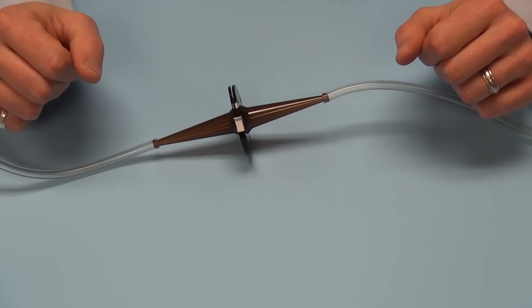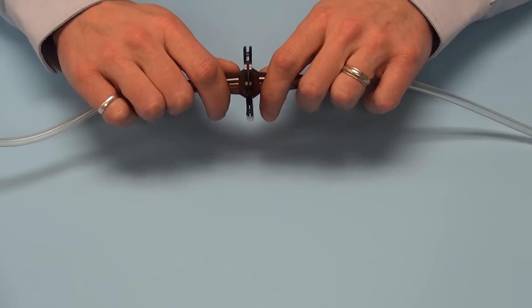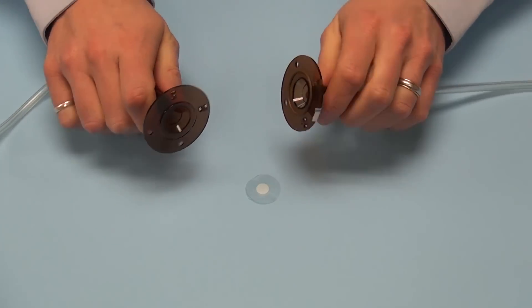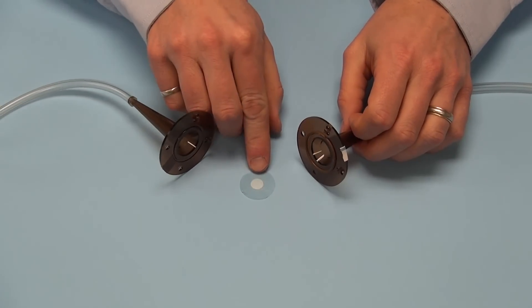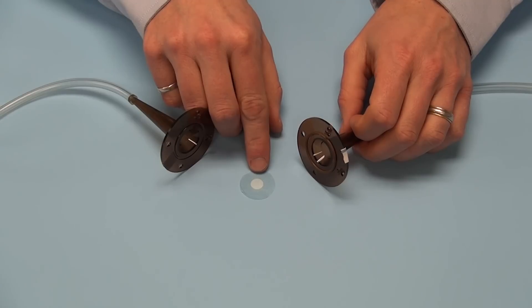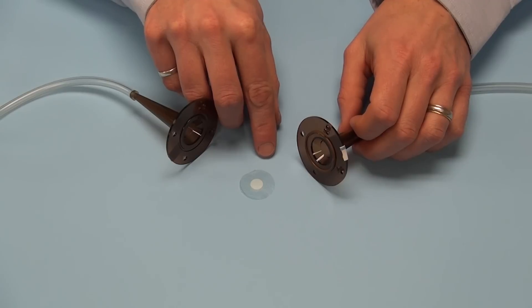Once the sterilization cycle has been completed, simply grasp the unit with both hands and break it open to locate the biological indicator disc at the center. The disc is now ready to be transferred to the lab for an aseptic transfer into culture media to be incubated to see if your sterilization cycle was successful.